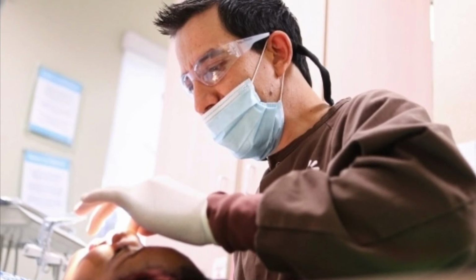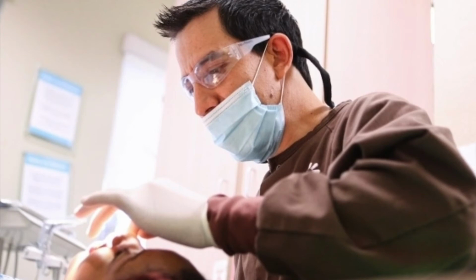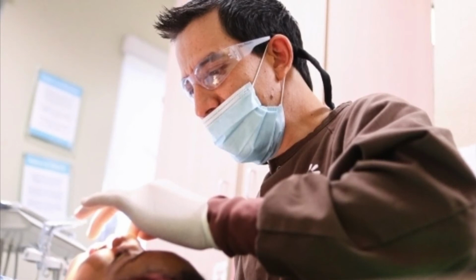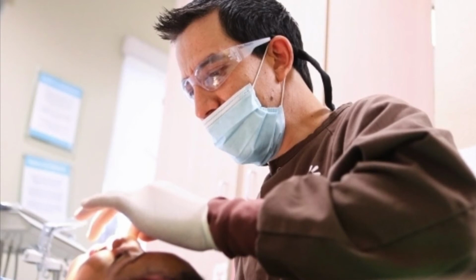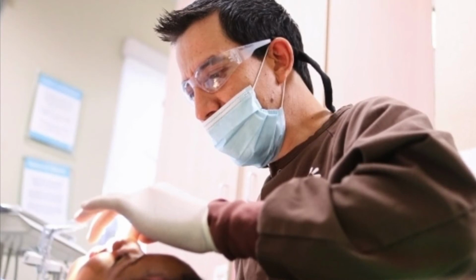The root canal preparation should be limited to this junction and form a constriction to prevent over-instrumentation or over-obturation. As you hear me, this is very important to know, the dentino-cemental junction. It is the last point the instrument has to reach.